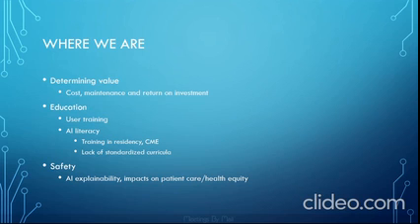But on the other hand, the wide deployment of AI applications may reveal biases in algorithms that may not have been apparent on a smaller cohort. So monitoring is necessary to ensure that the algorithm is performing in an equitable way on different populations in different practice settings. In short, AI should function to lessen health disparities and not deepen them.